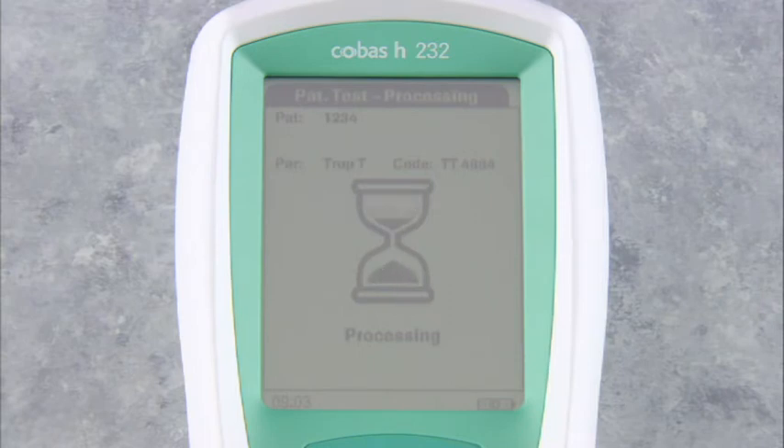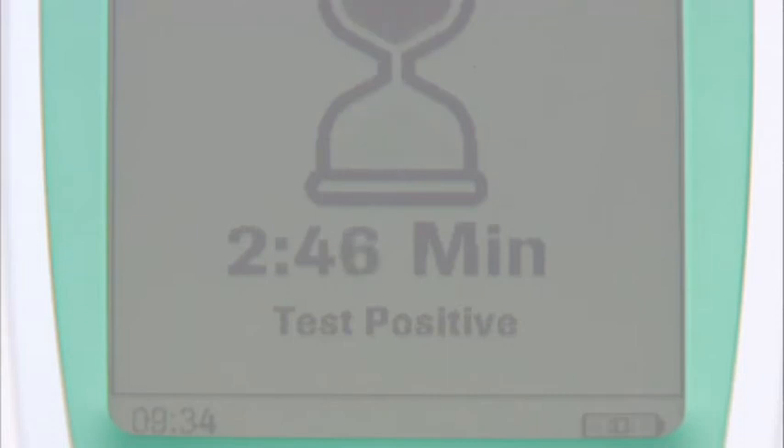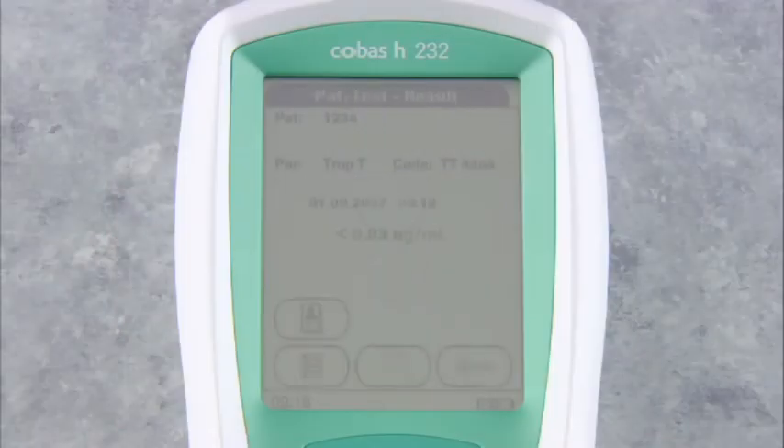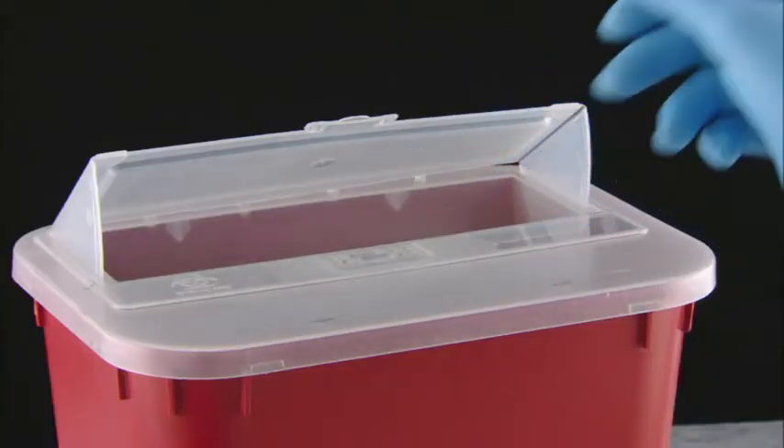An hourglass appears on the screen indicating that the meter is processing. In about two to three minutes, the countdown begins. If the troponin T level is highly elevated — above 0.1 nanograms per milliliter — the screen will indicate a positive test even before the quantitative result is available. This special feature is only available for troponin T tests. Within 12 minutes, the result appears on the screen and is stored in memory. Other tests take either 8 or 12 minutes for the result to appear, depending on the parameter used. Remove the test strip and dispose of it according to your facility's guidelines.